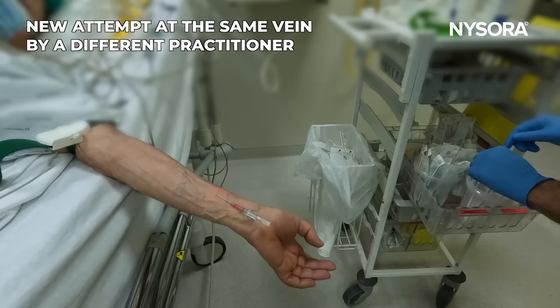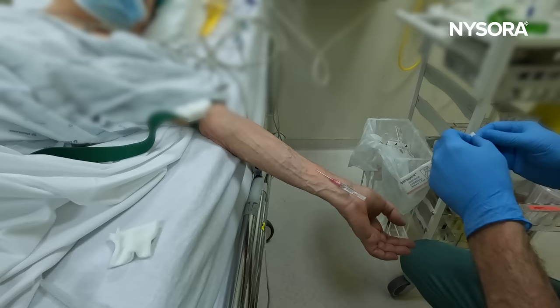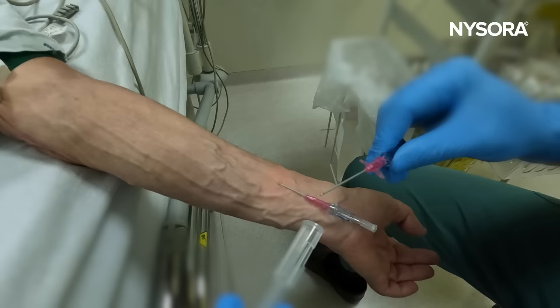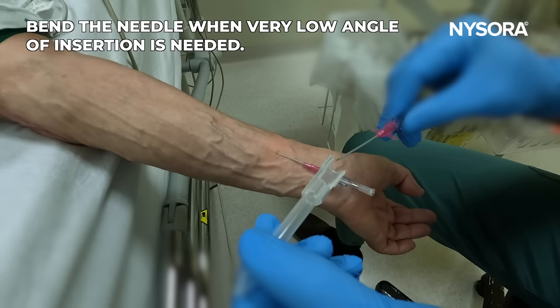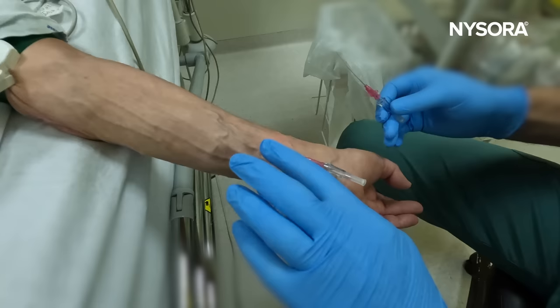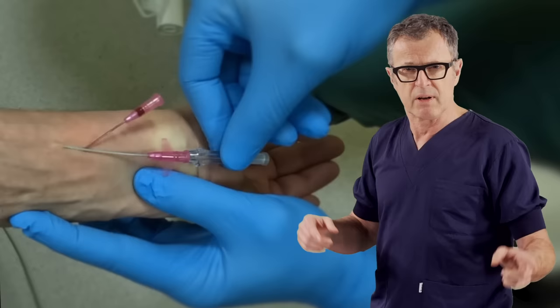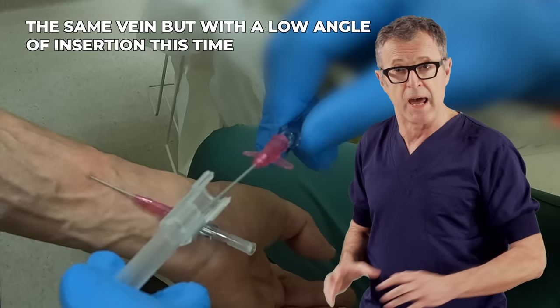Allow some time for the tourniquet to work. Here's another practitioner who steps in and chooses a longer IV needle catheter system. The new practitioner also bends the needle to be able to assume a very low angle of insertion, which is a technique that helps greatly in difficult cases. Because the vein is very superficial, this way you can actually make the lift. We opted to demonstrate the importance of point number three and number four: keep the angle of needle insertion very low, and pre-bend the needle to be able to lift the tip up and remain superficial in the plane of the vein.